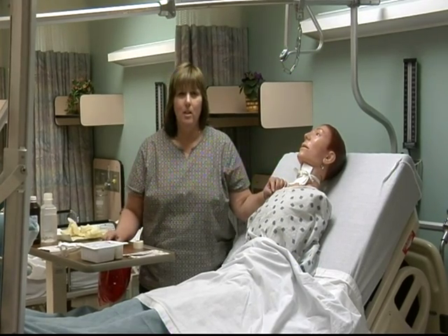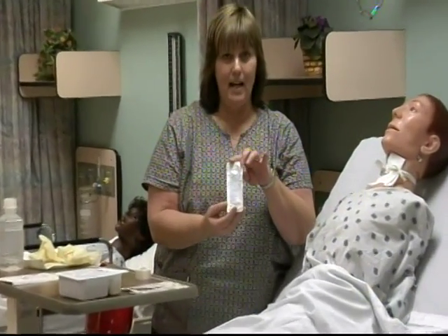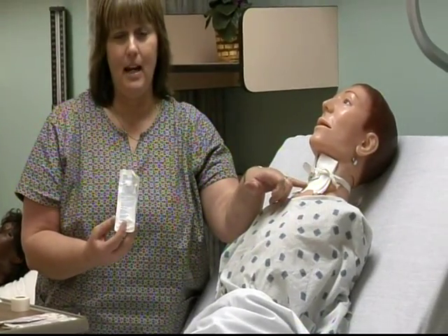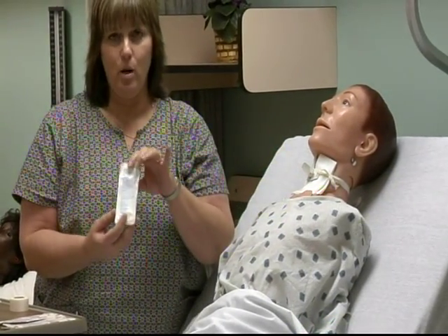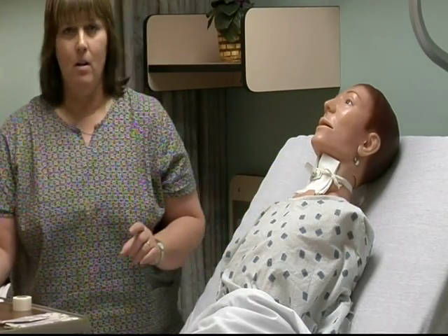The very first thing you need to make sure is that you have the new inner cannula that matches the cannula the patient has had, because you do not want to have the wrong size here and try to insert this into your patient. All the supplies that you will need are listed on your sheet, but I will go over those briefly with you.